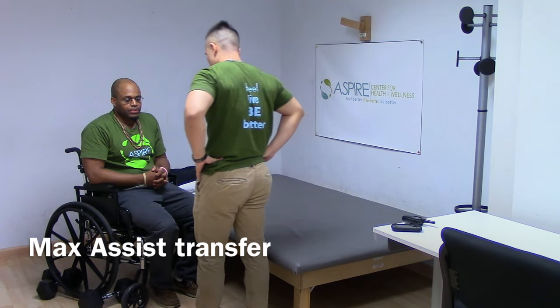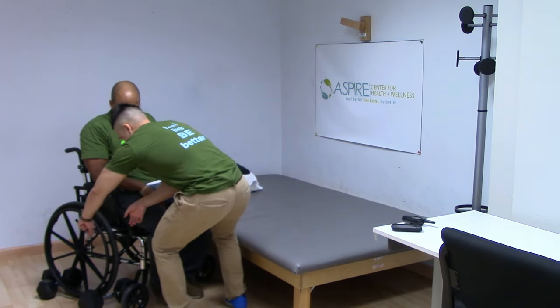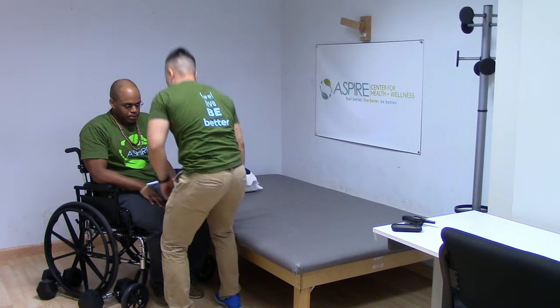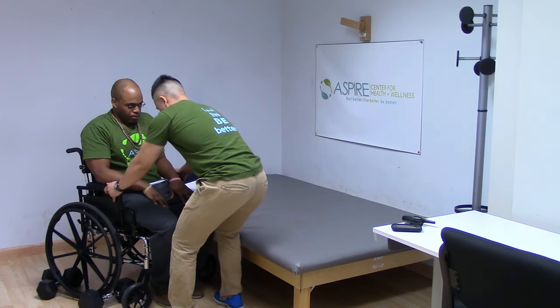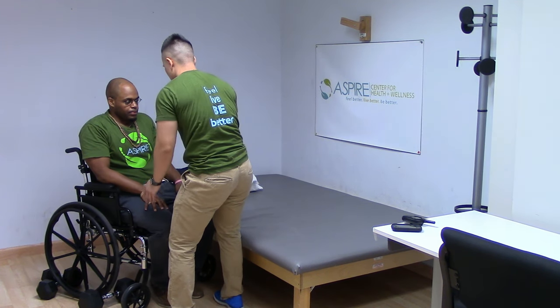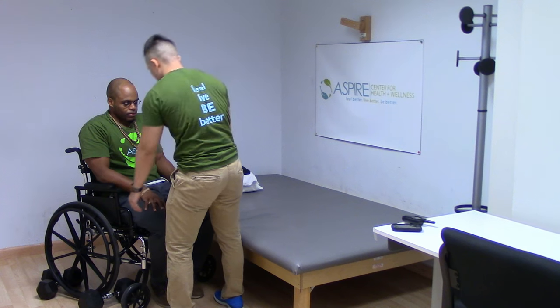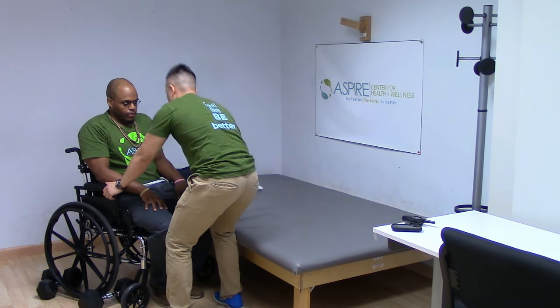To perform a max assist transfer of a patient from their wheelchair to the mat, first you must remove the leg rests. Then, position the wheelchair with the patient's assistance so that it is as close as possible to the mat. Angle the wheelchair so that the patient is slightly facing the mat. Make sure the brakes are locked — this is very important.